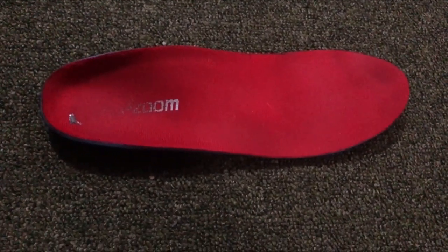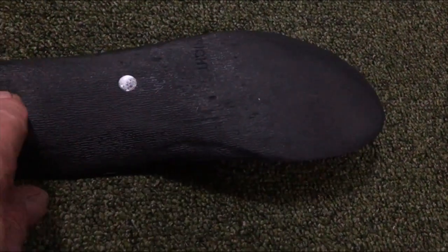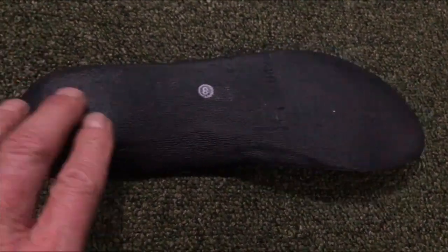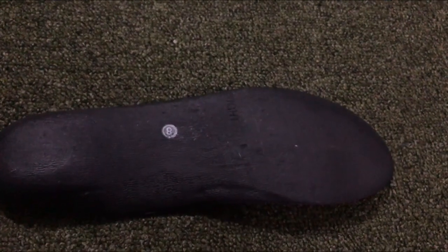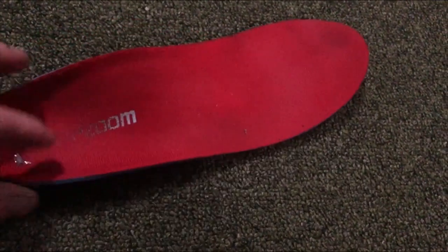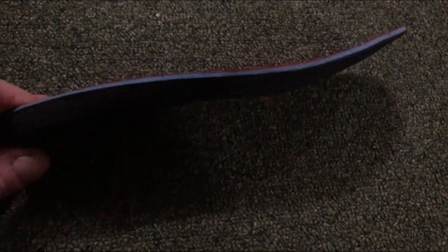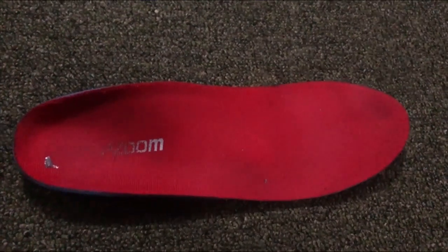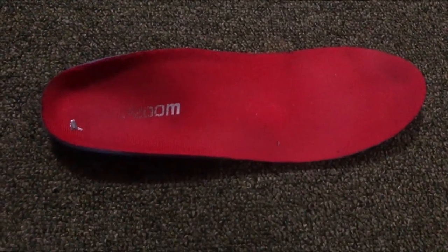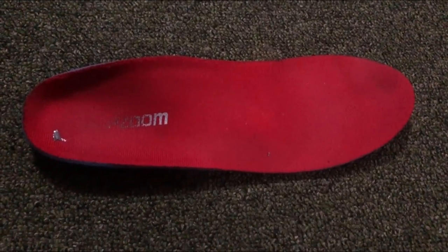This one is not actually for sports or running, so it hasn't got the extra cushioning on the bottom like other ones — such as the Footsy brand I've reviewed previously. It hasn't got any gels, but it's really good for general usage. I do use it in my trainers for running since those already have gel built in, so it does the job very nicely.